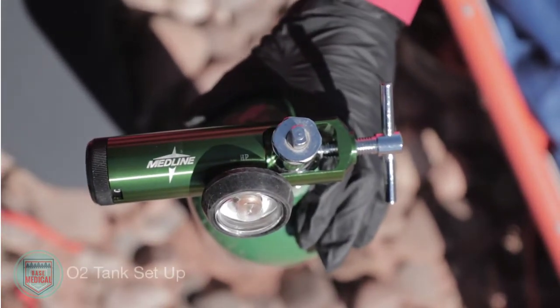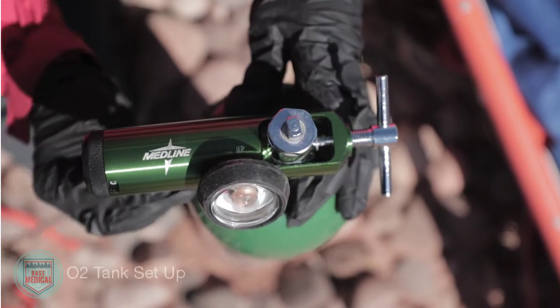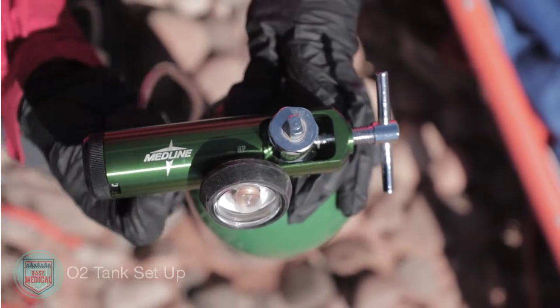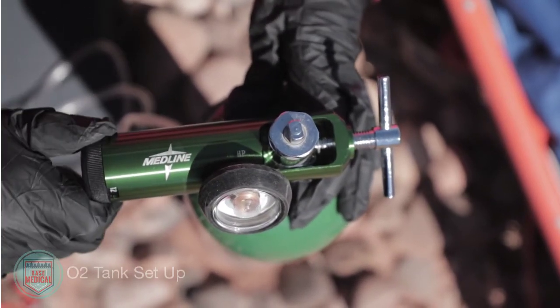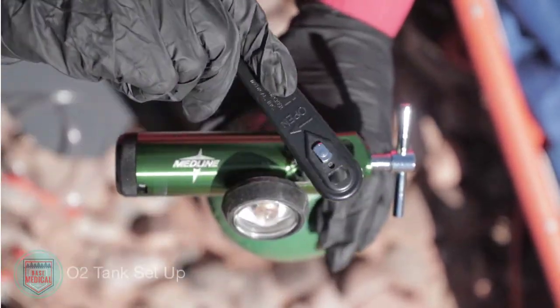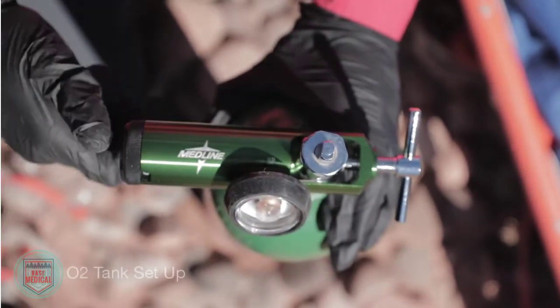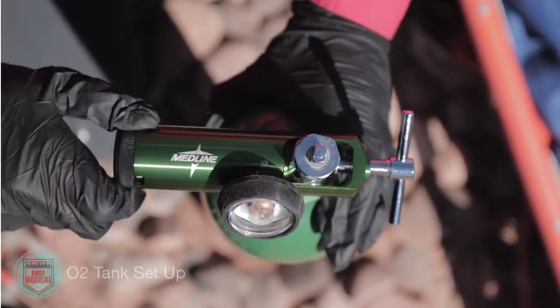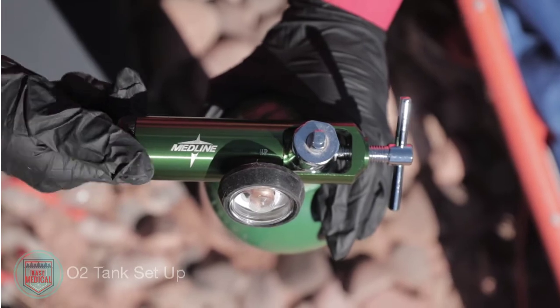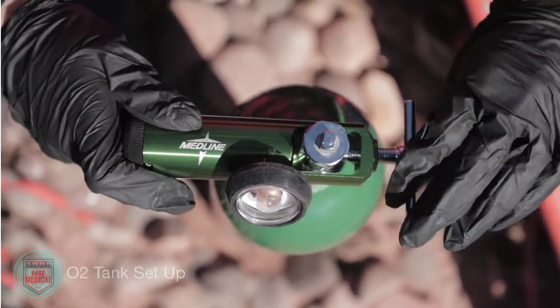Attach the oxygen delivery device of your choice and adjust your flow rate. To remove the regulator, close the tank valve with the O2 key, drain the regulator of any residual oxygen, then remove the regulator.